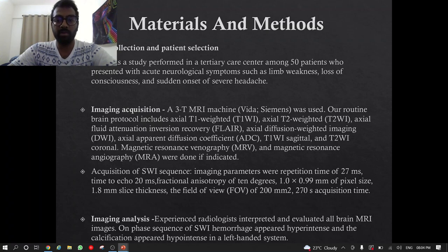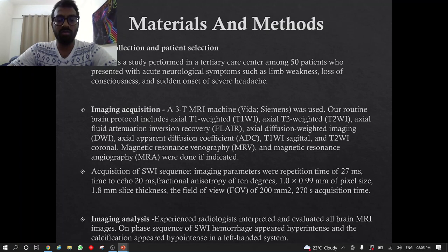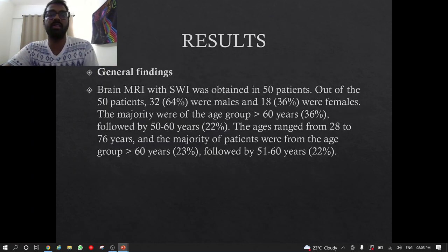SWI sequence image parameters: repetition time of 27 ms, time to echo 20 ms, flip angle of 10 degrees, 1.8 mm slice thickness, field of view of 200 mm square, and 270 seconds acquisition time. Experienced radiologists interpreted and evaluated all brain MRI images. On the phase sequence of SWI, hemorrhage appears hyperintense and calcification appears hypointense in the left-handed system.